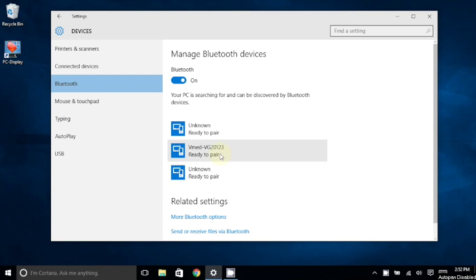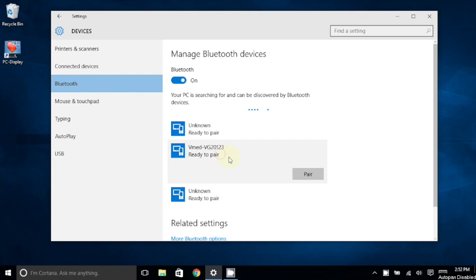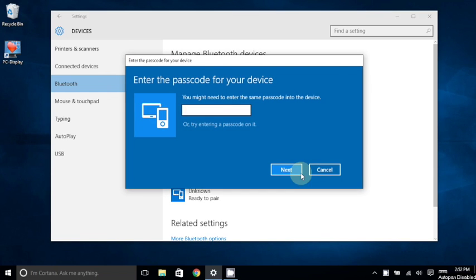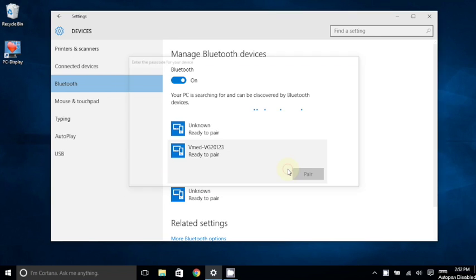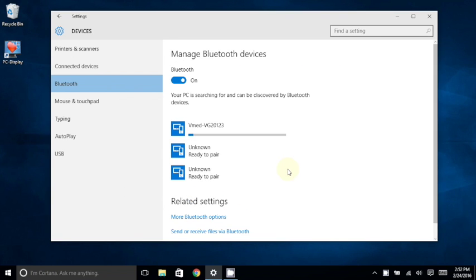In this case, I'm connecting to a VetGuard Plus. Once you select it, choose Pair, and here it will ask you for a passcode. Use the word default in all lowercase, and then choose Next, and allow it to complete its pairing.